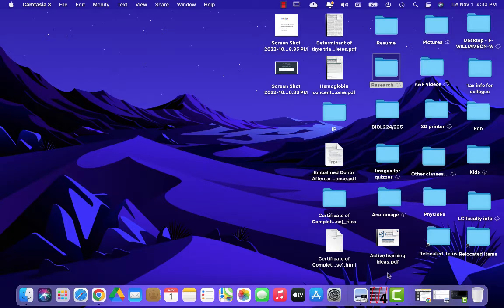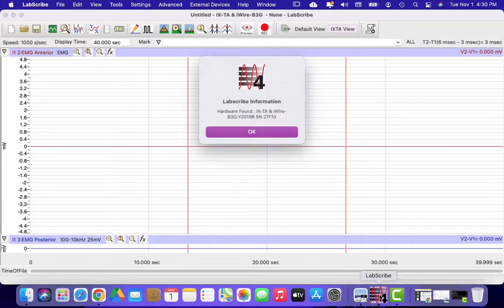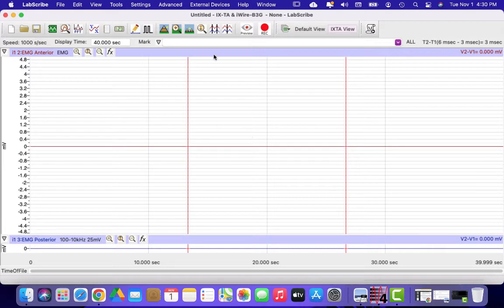Once you're all set up, go to the desktop and open up LabScribe. You should see a box that tells you that the hardware has been found. If you don't see that, you need to make sure your data acquisition box is turned on. Hit OK.